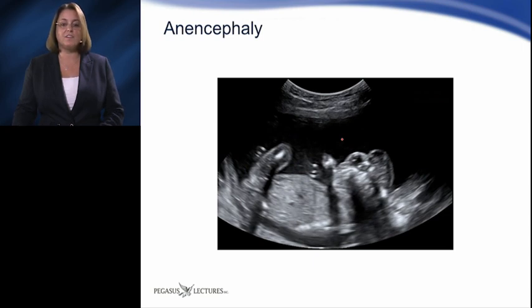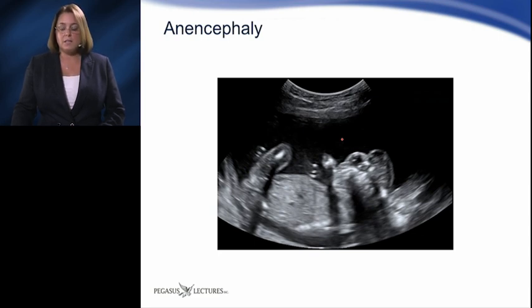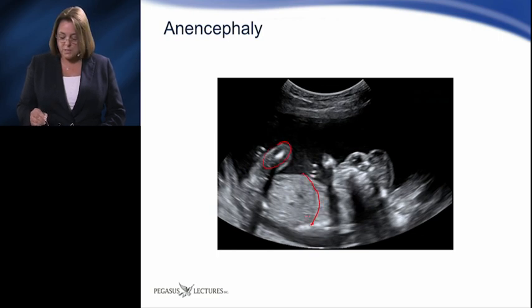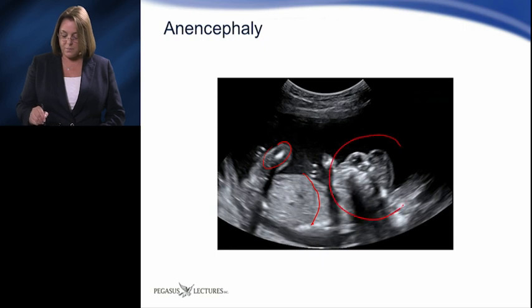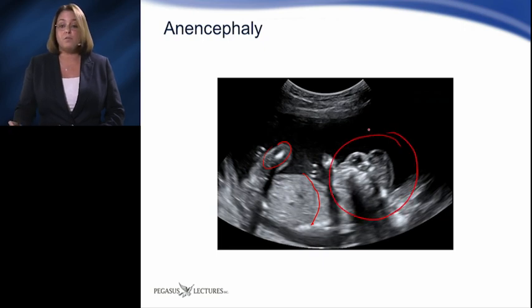Anencephaly is another lethal congenital fetal brain disorder where, in addition to no skull, there is no brain tissue. In this image, we see part of a fetal femur, part of the diaphragm, and some of the fetal facial features such as the orbits, but we're not seeing the skull and we're not seeing the brain. Therefore, this image demonstrates anencephaly.